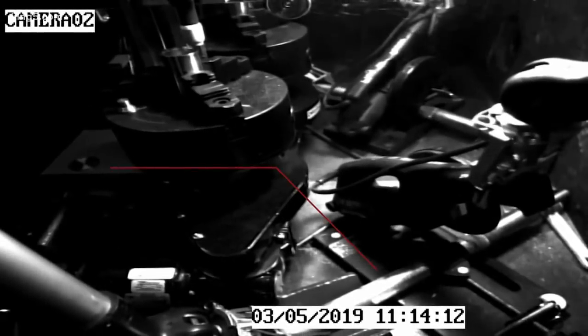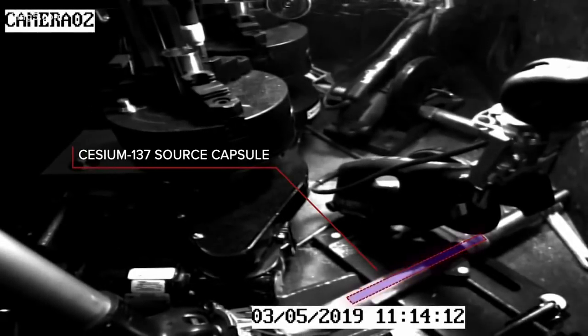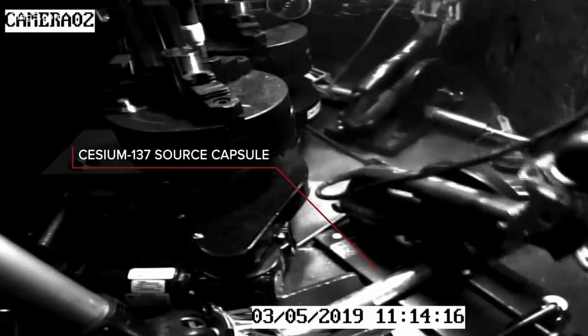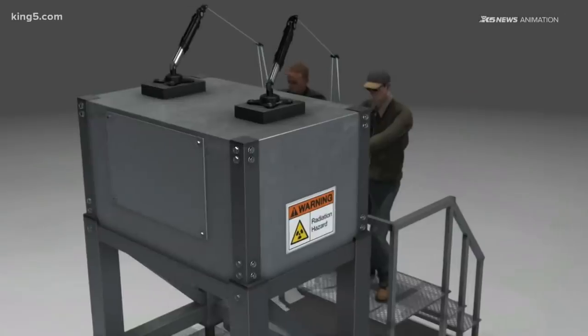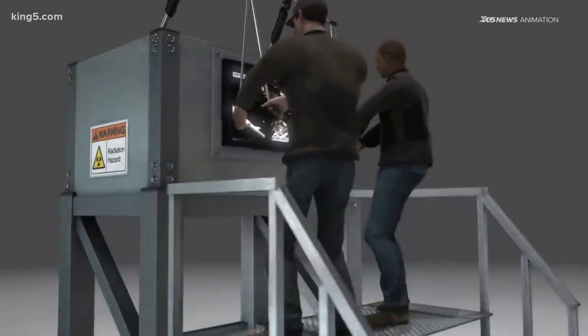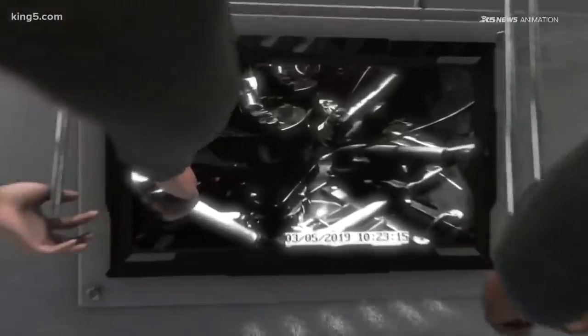This never-before-broadcast video, released by the feds at King 5's request, shows the contractor's blunder. The cesium capsule is in this tube clamped under a cutting blade. Sparks fly when the saw pierces the tube as the contractor tries to cut the cesium from a separate pipe that it's mounted to. The contractors are outside a lead box called a mobile hot cell, which has been staged on the Harborview Research Building loading dock. They're using robotic arms to handle the cesium capsule and tools on the inside and are watching on a live video feed.